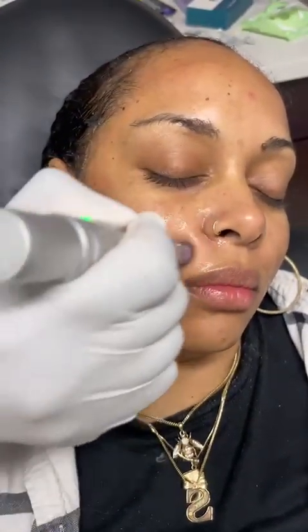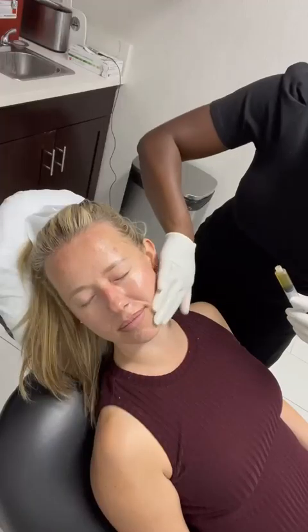This is the first client. She wanted microneedling PRP to get face rejuvenation. I'm using Juventix's microneedling pen and their microneedles to perform this procedure. Look how easy the microneedling pen glides on the client's face — no discomfort at all.